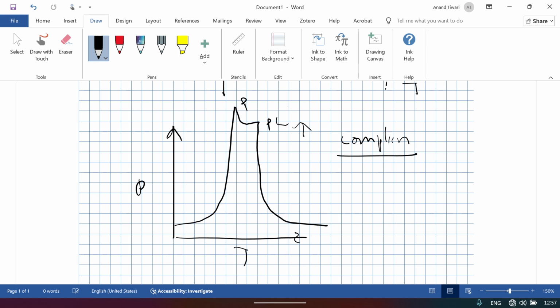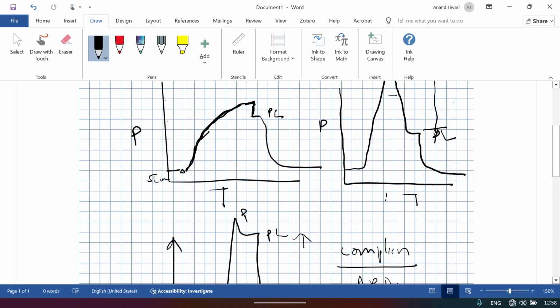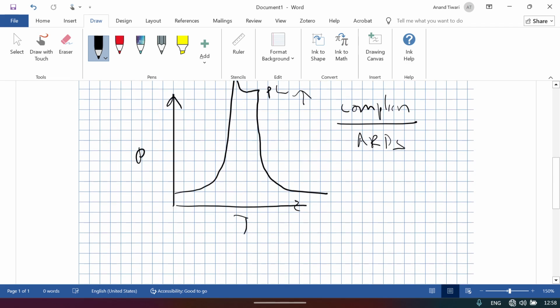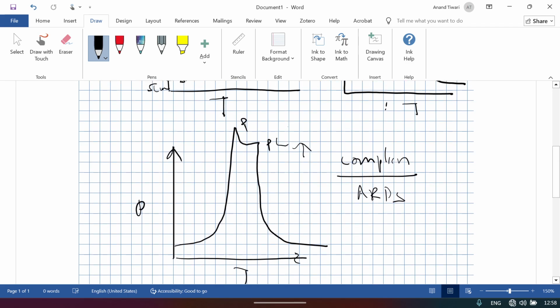And what are the various problems that can be there? There may be pneumothorax, so auscultate the patient. The patient may be having a pulmonary edema, positive fluid balance, or consolidation, or ARDS. So from these two patterns, an increase in peak pressure with a difference between peak and plateau is a resistance problem. If there is not much difference and peak and plateau are both increased, then the problem lies with the compliance.